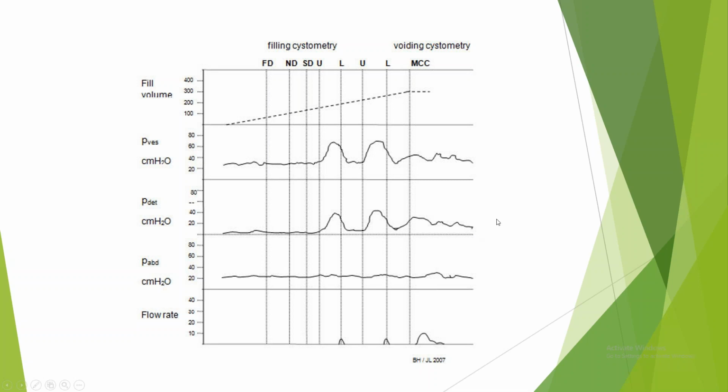Got it? See, if you miss something in voiding, then no problem. But at least you should know the correct thing during filling. The incontinence diagnosis should be correct. I am telling you about voiding just to complete this. But in the filling phase, your diagnosis should be perfect.